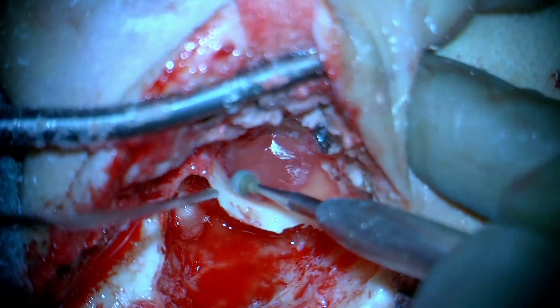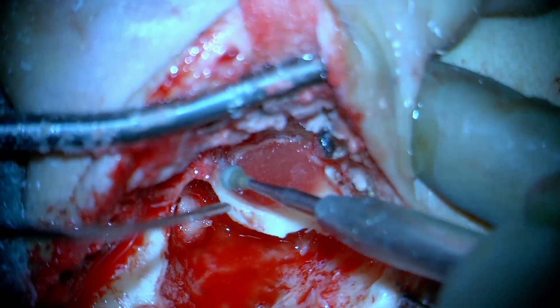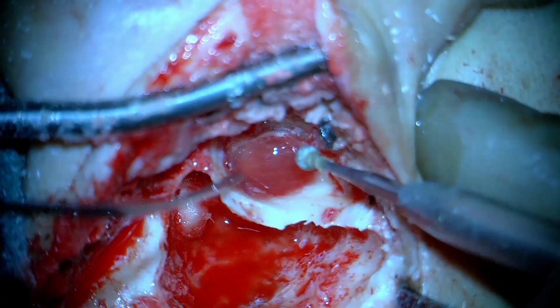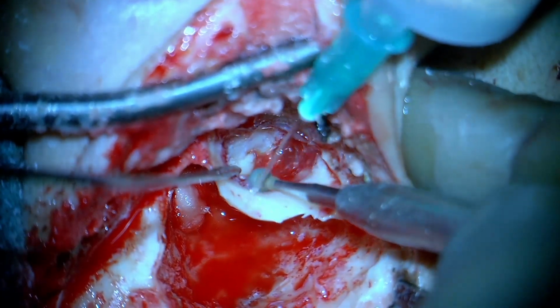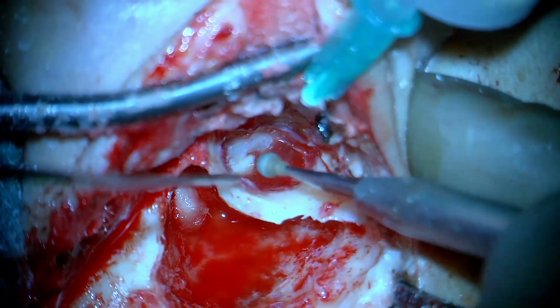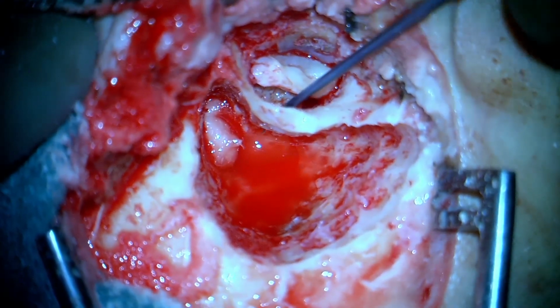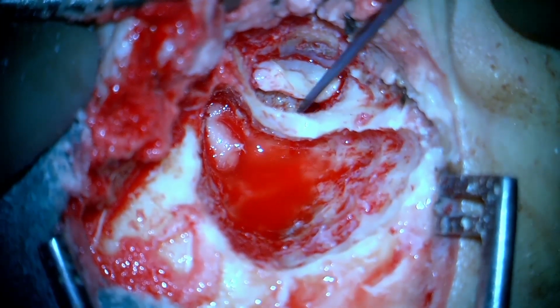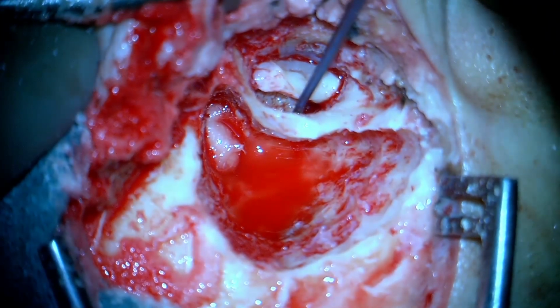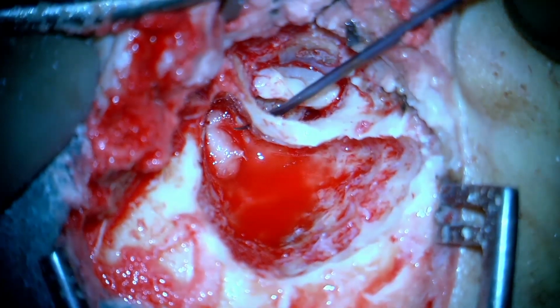Once again, very cautious to not excessively thin or fracture the canal wall, because that would definitely jeopardize the entire procedure. So we're just taking the diamond burr carefully in, drilling off the granulations that are there on the canal wall anteriorly. I would say that this is the canal wall defect I was talking about that we saw in the CT. It's a large size defect covered by just some mucosa or granulation tissue like you saw.